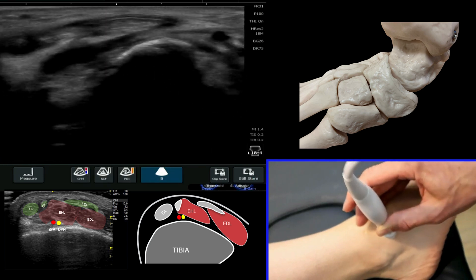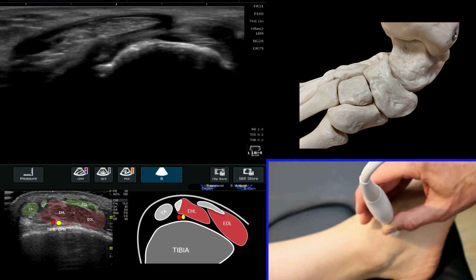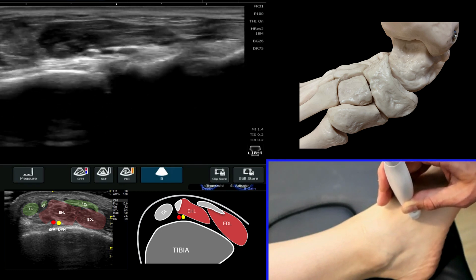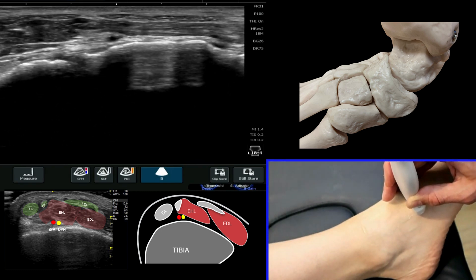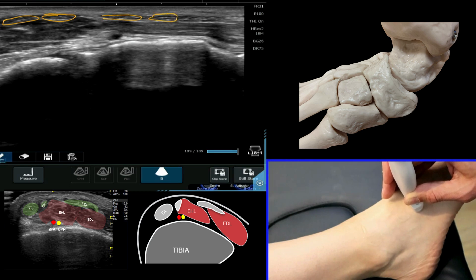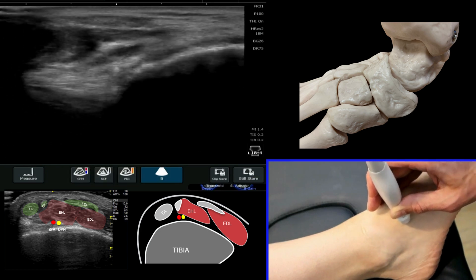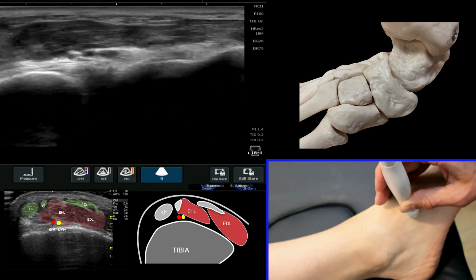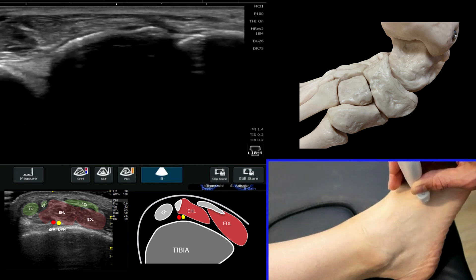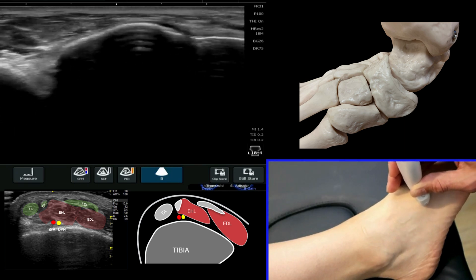As we come down more distally, we can see this is the extensor digitorum because it starts to spread out across at least the width of the probe into individual slips, which we can highlight very clearly. At the top of the screen you can see how superficial they sit — it's very easy to miss these if you're new to interrogating this area. They then come down into the foot and really spread out into individual slips.